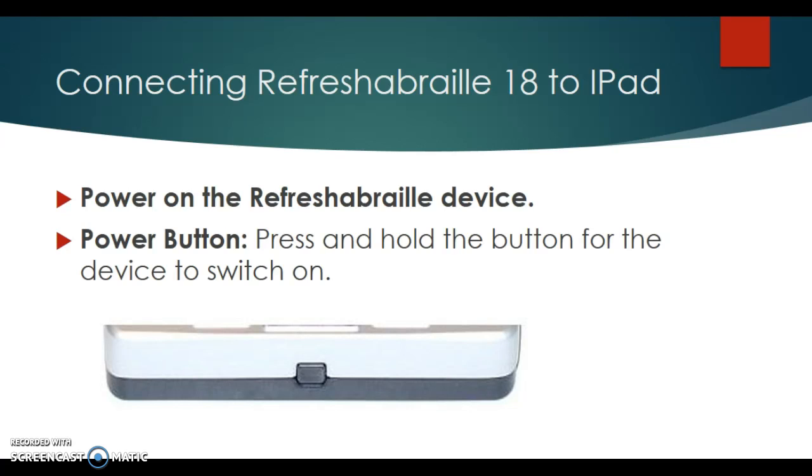We have to make sure the Refreshabraille device is on, and to power on, you see the power button right here. You press and hold the button for the device to switch on, and you will have to make sure the iPad is on. Once you switch on the Refreshabraille device, you do not have to deal with the device after that.